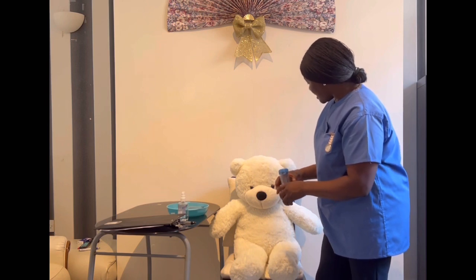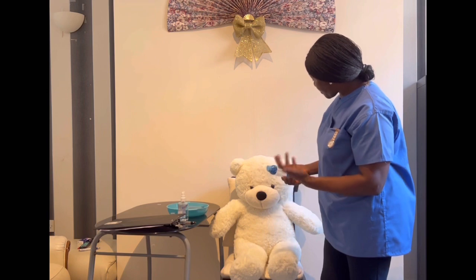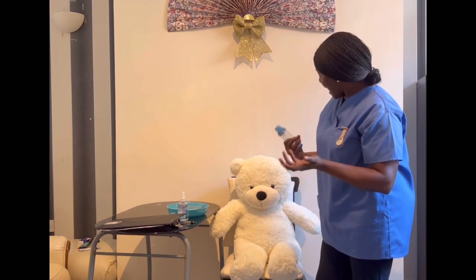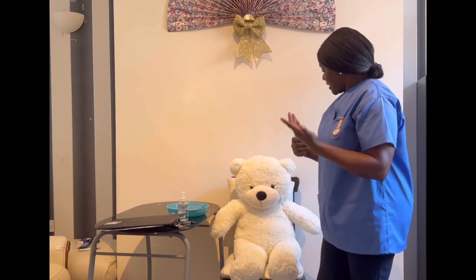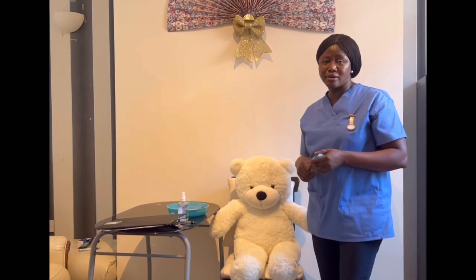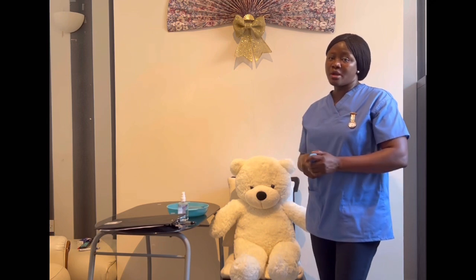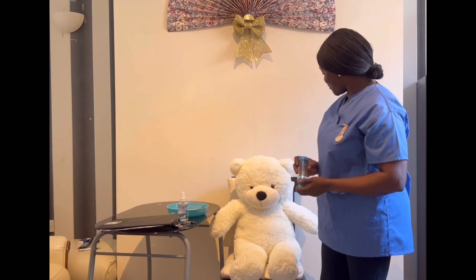Is that all right? From time to time, take deep breathing exercise. Follow the prescription as advised by your doctor. Avoid any form of irritants that can aggravate the asthmatic attack. Then, after using your inhaler, it is advisable to rinse your mouth with water and spit it out. This will help to reduce the side effects. Deep breathing exercise is going to be helpful as well. Is that okay, Harry? Yes, nurse.